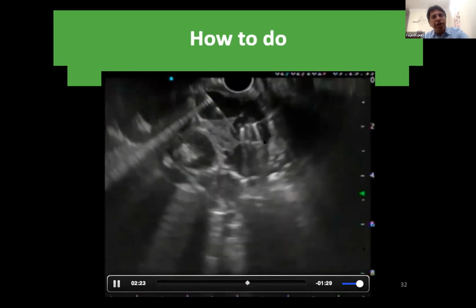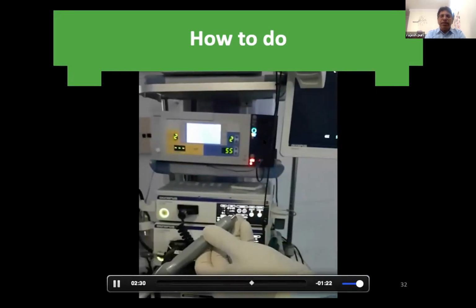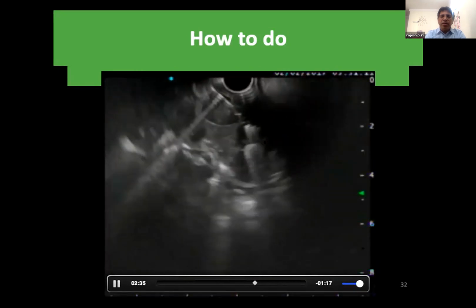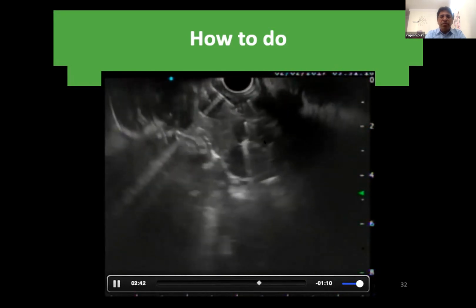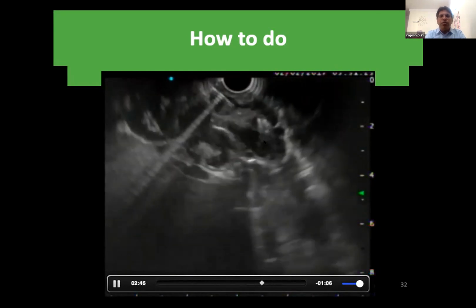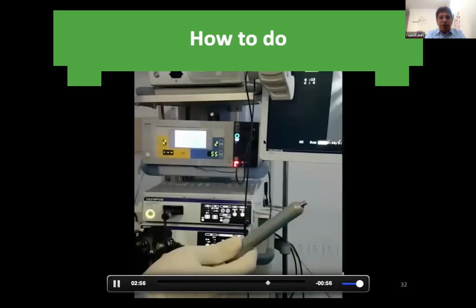Depending upon the need, you can introduce 2 coils or 3 coils. Once we deploy the coils, this is the second coil which has come. They produce turbulence of the flow and reduce the blood flow. Once you know that you have injected an adequate amount of coils, the next step is injection of the glue.